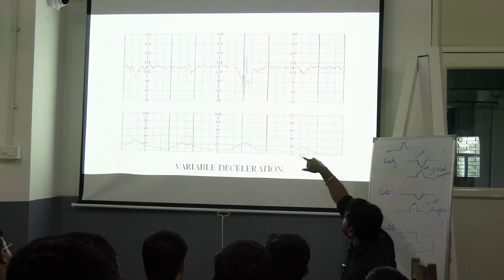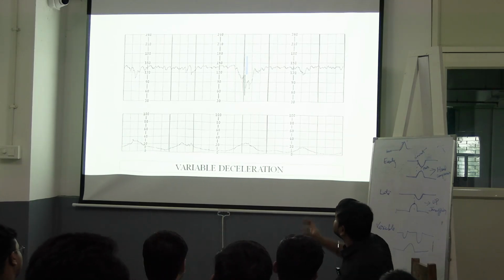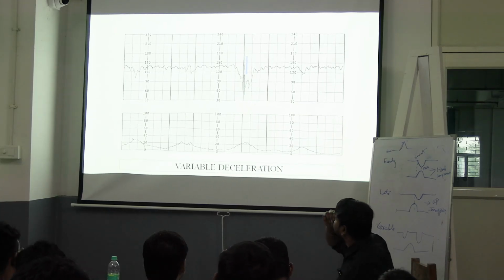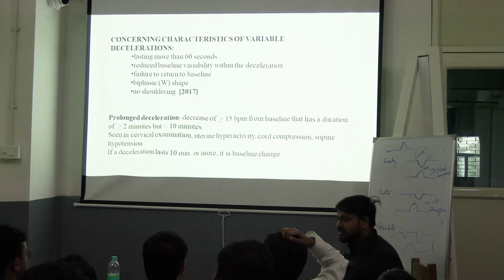Okay, there is a deceleration, but it doesn't depend on the contraction only. It can happen anytime. This is there. Next. Okay, I think we can finish the class.